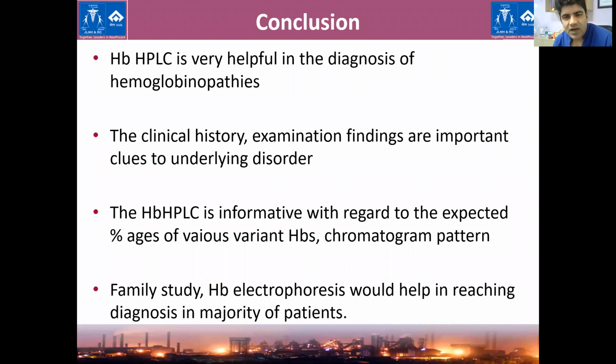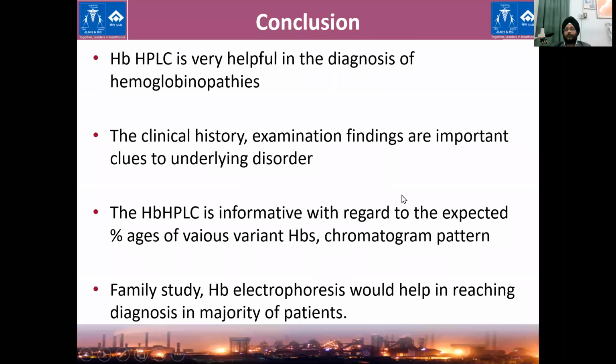Yeah. Now there's another question which is on the P3 peak. What does it denote, and does it increase with increase in HbA1c? The P2 peak increases with HbA1c, not the P3 peak. P3 peak is seen if the sample is old and has been run after a few days, so it shows that the sample quality is compromised, and we should always take it with the clinical setting.